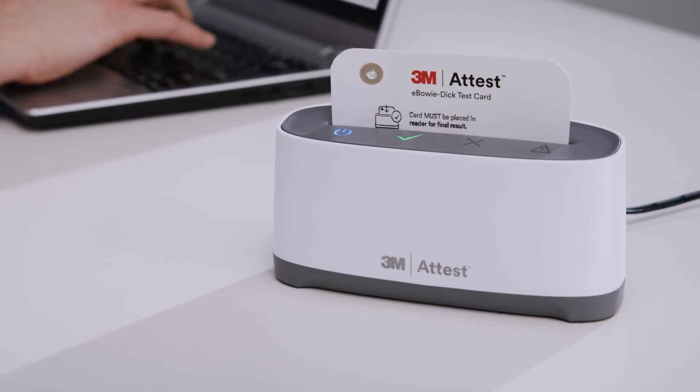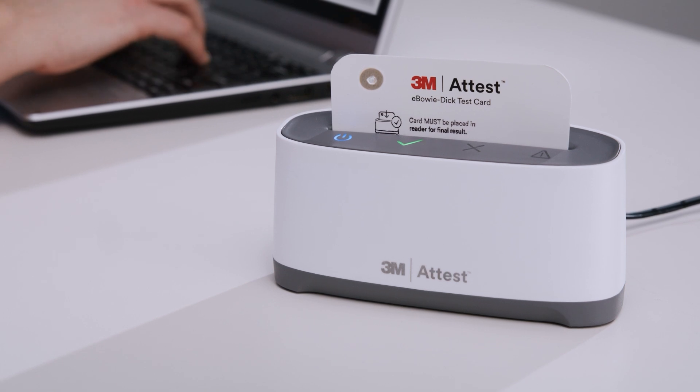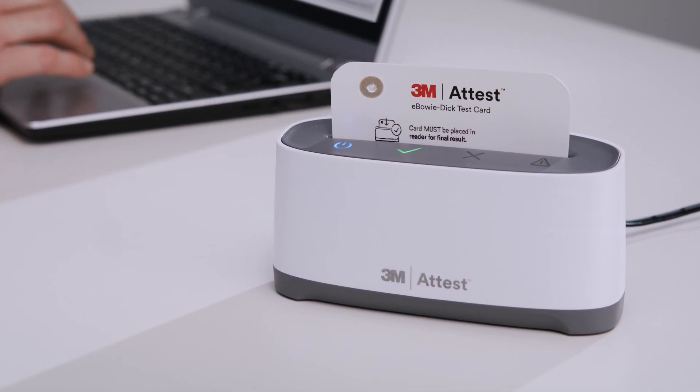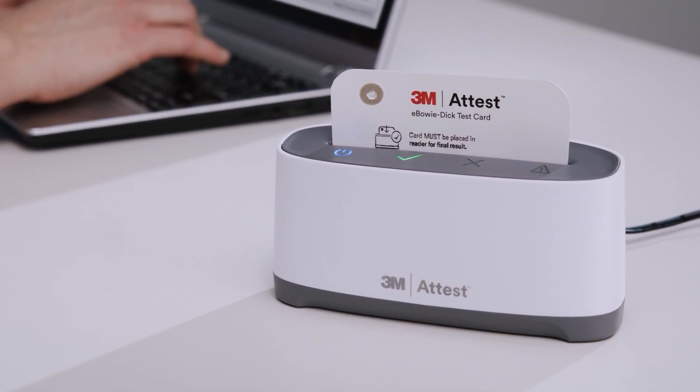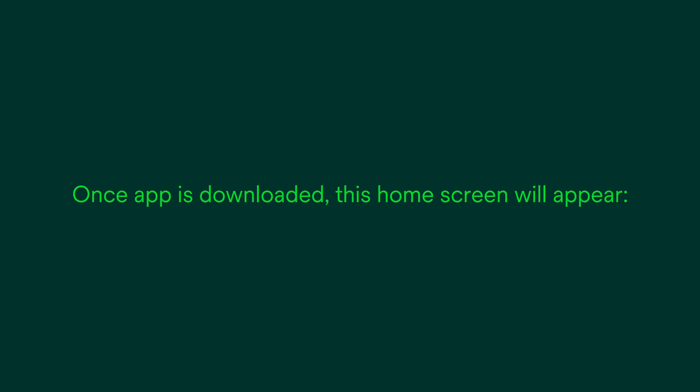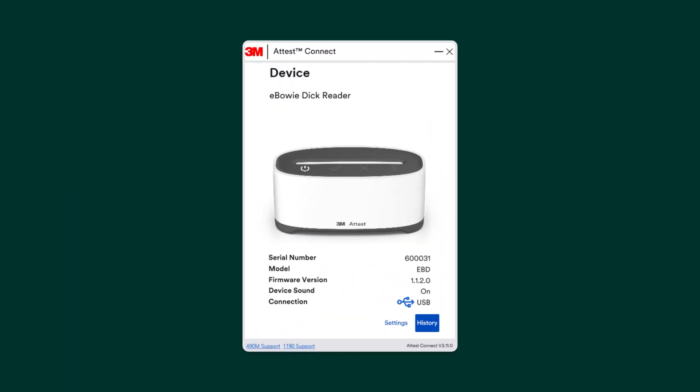But first, ensure the 3M Attest Connect PC application is downloaded to your computer. Once the app is downloaded and your auto-reader is connected via USB or Bluetooth, this home screen will appear.